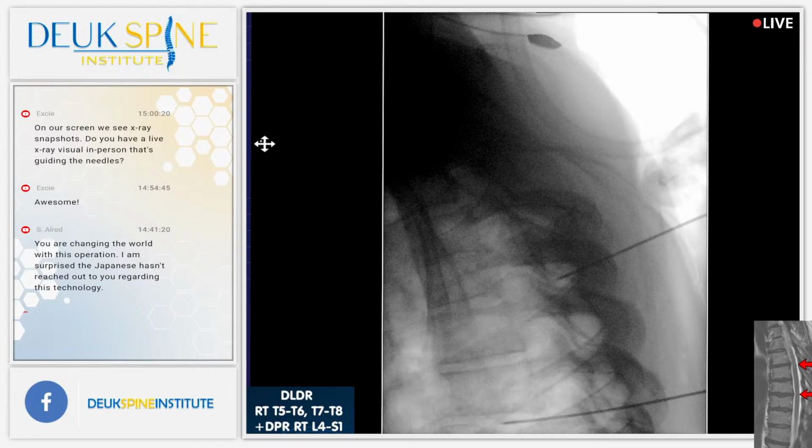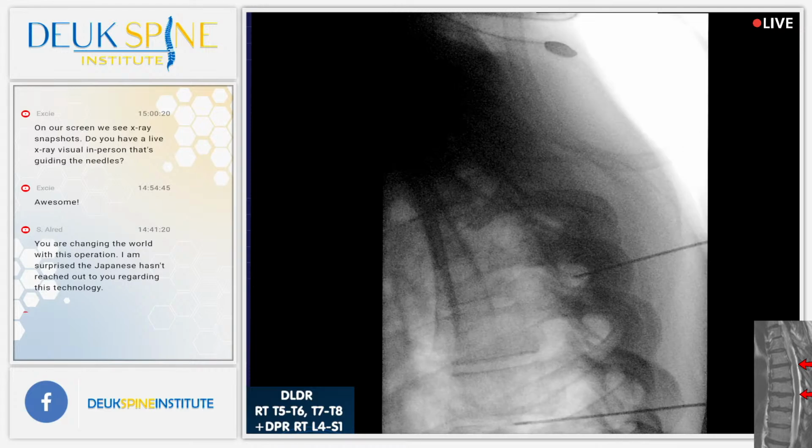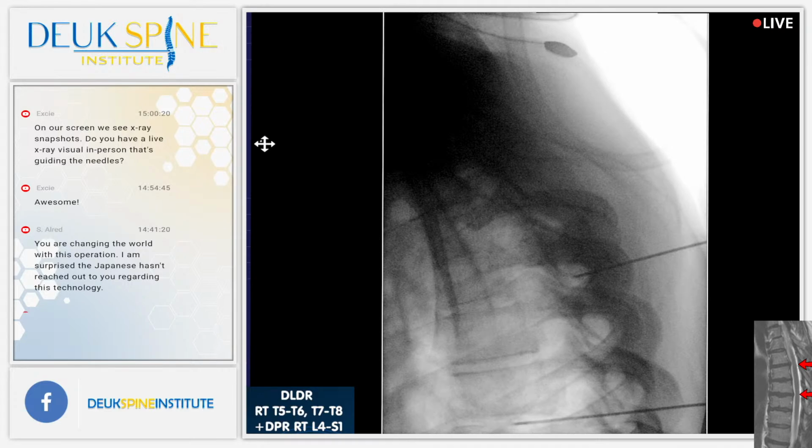Yeah, you do. There's no doubt. That's what I'm dealing with. What I'm trying to figure out is, is it worth the risk? If you don't have much pain up here, maybe we don't take the significant risk that it takes to get down to that disc, because I'm encountering a lot of bone. I cannot find a way around it at the top one, which is the one that doesn't bother you that much. Let's get an AP. What do you say? I'm just thinking out loud for you.